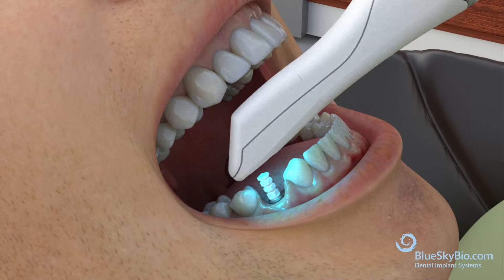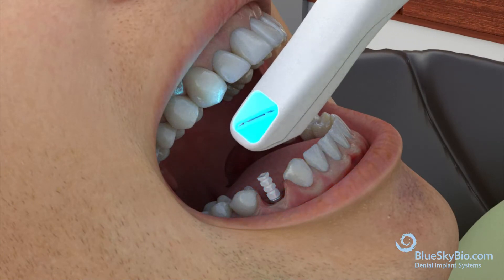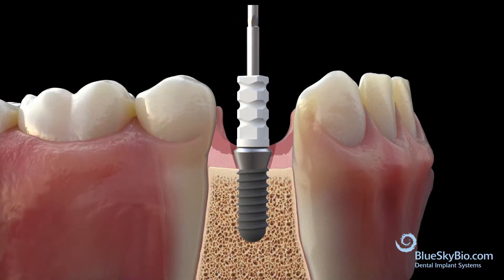Next, scan the lower arch. Scan the opposing arch. Once scanning is complete, remove the scan abutment.